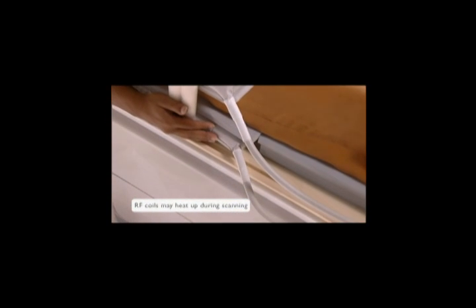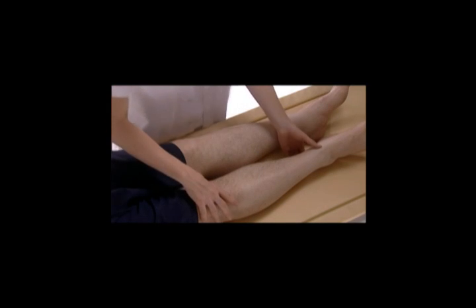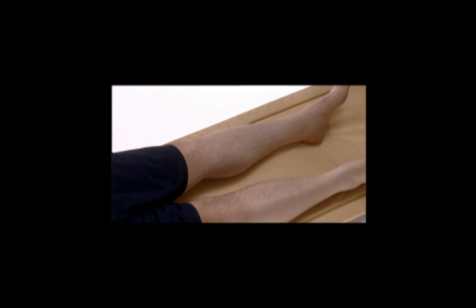A cable or component in contact with the patient's skin can heat up and cause a burn. Currents running below the skin can cause internal burns. In this case, the component is not heated. In the case of skin-to-skin contact, the surface area is small so that high-energy discharges can occur.